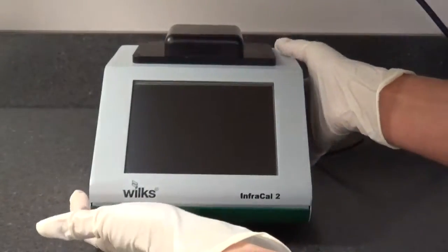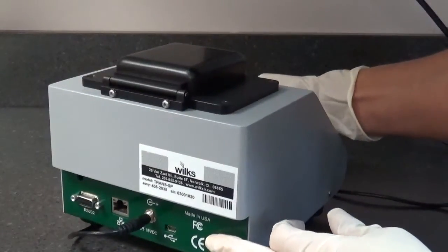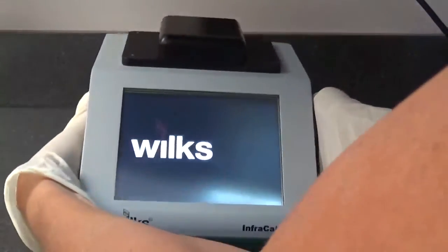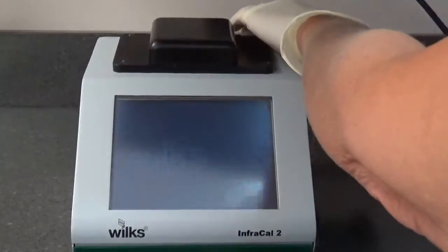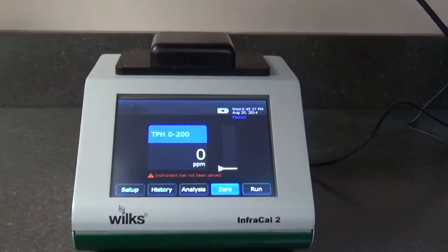The InfraCal 2 analyzer is designed for on-site measurements and is relatively insensitive to vibration and ambient temperature changes. It is recommended that the instrument be allowed to warm up for one hour prior to use. The InfraCal 2 analyzer draws very little power and if used daily, it can be left on at all times unless operated from the internal battery pack.